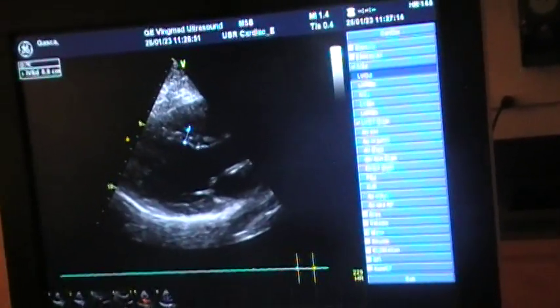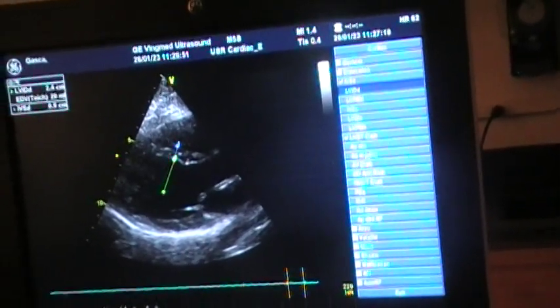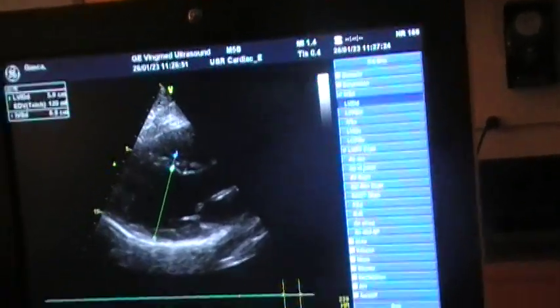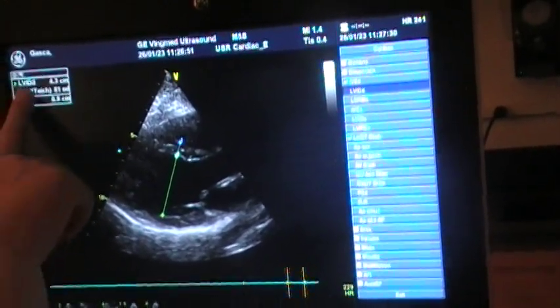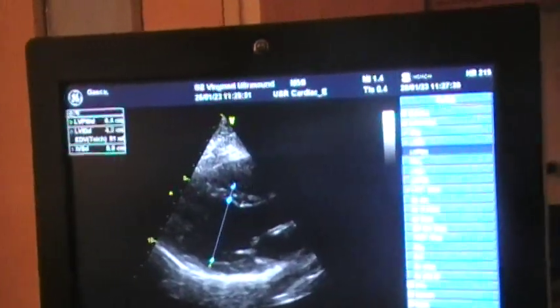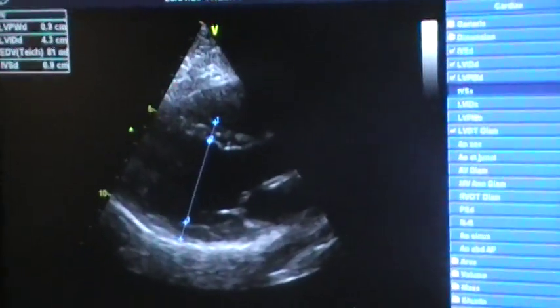interventricular septum, and then it'll let you click again here, come down, make sure you're getting just the wall. You don't want to come all the way down. The wall's right there. And so you're going to get that for your left ventricular internal diameter. Click again, and then that is your posterior wall. And all of these are your diastolic measurements. Some places will measure the right ventricle too. And then just take your picture, don't unfreeze.